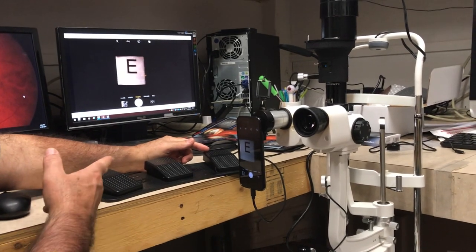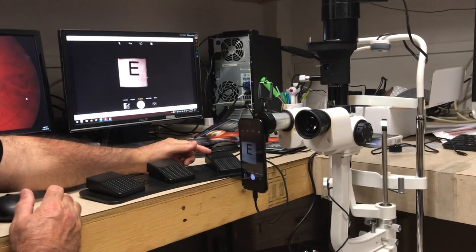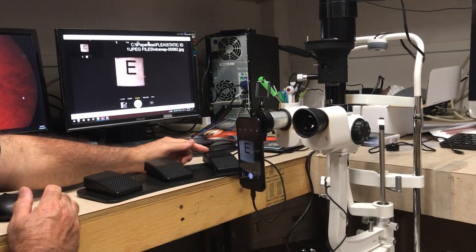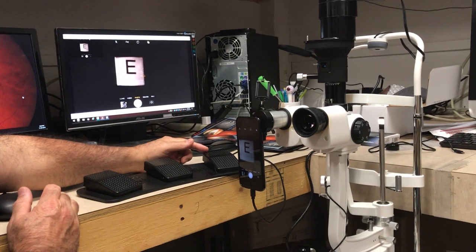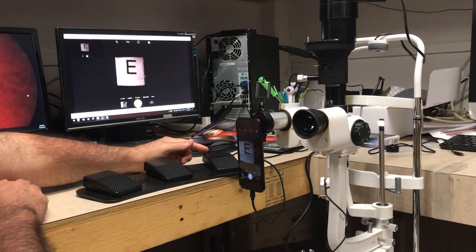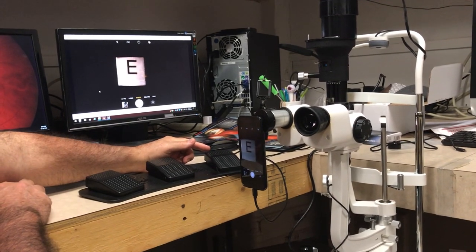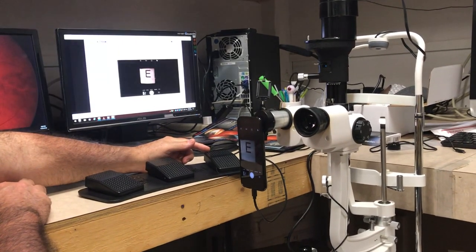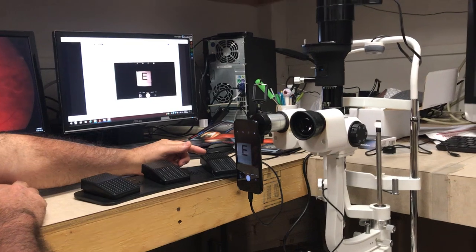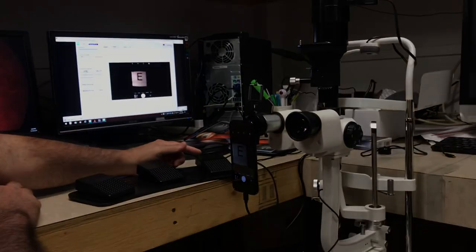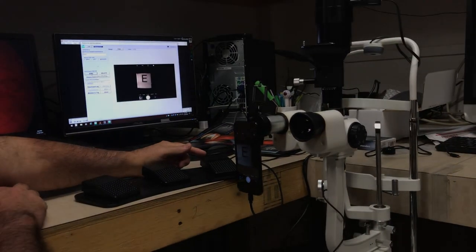So, with a foot pedal, we capture the image. You see the thumbnail up at the top, and then it pops up into our Fleet iPaperless software.